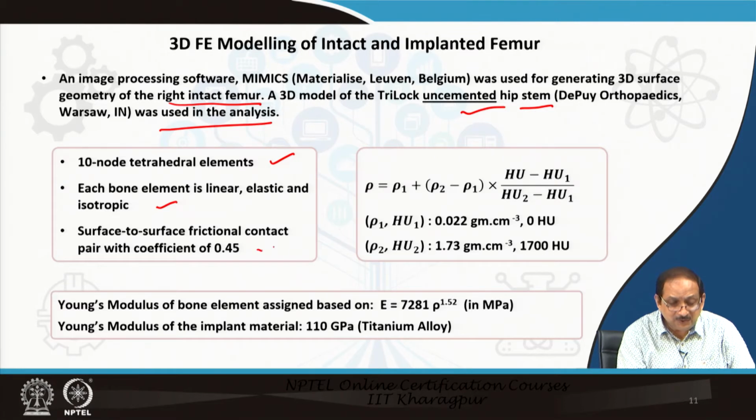There are surface-to-surface frictional contact elements with coefficient of friction 0.45 in the contact simulation employed at the implant-bone interface.